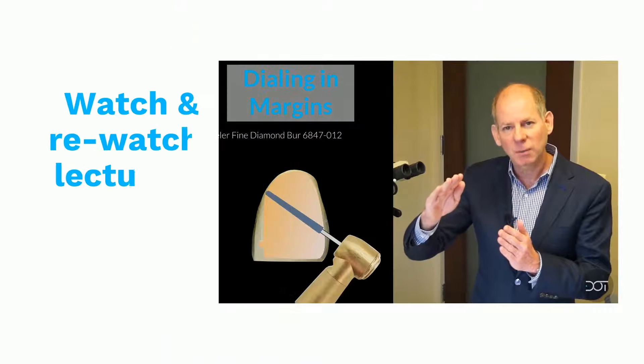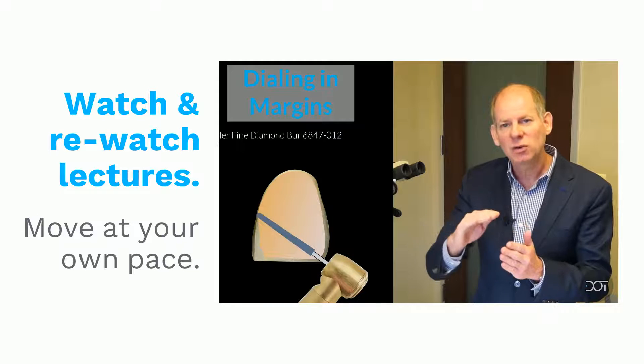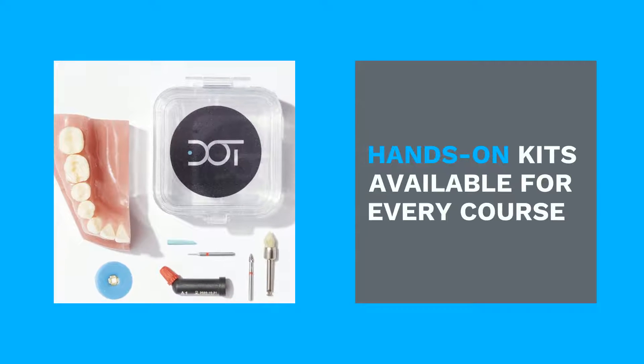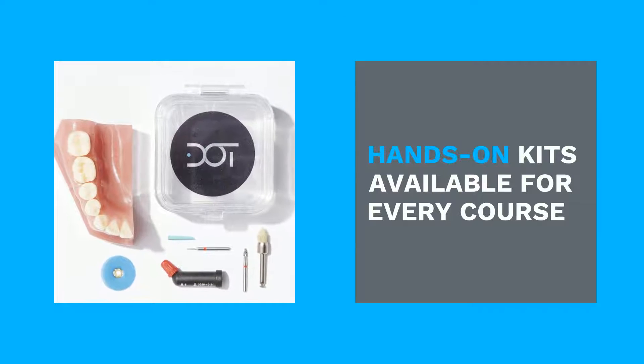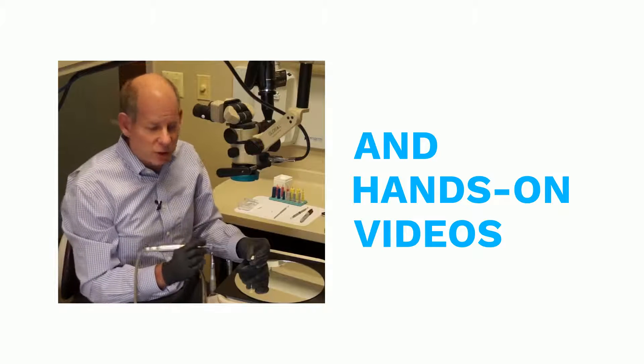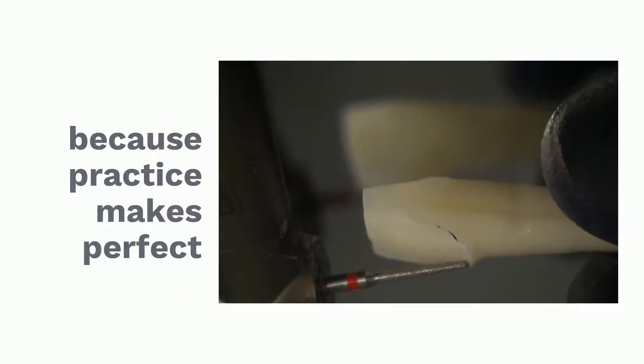As you'll see in the illustration, I'm going to start moving the burr into the contact zone, just facial to the contact margin. Finish lining, making it nice and smooth with my red stripe burr with nice gentle pressure. Make sure I keep my three planes of contour and I'm just going to work over that.